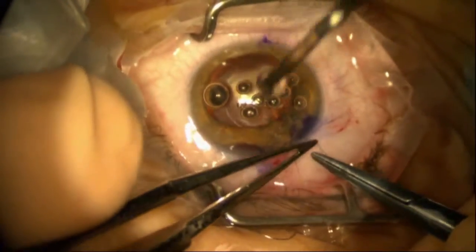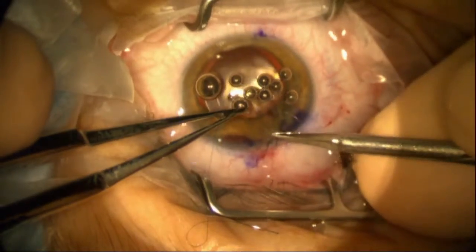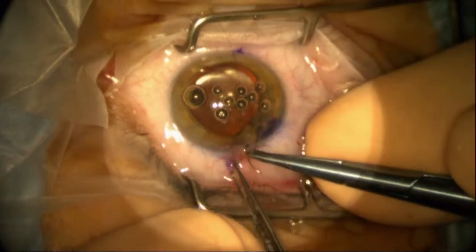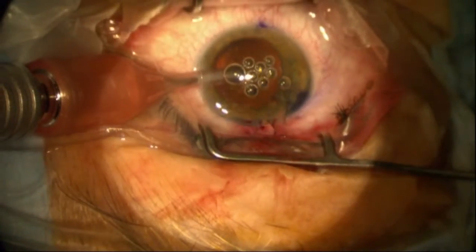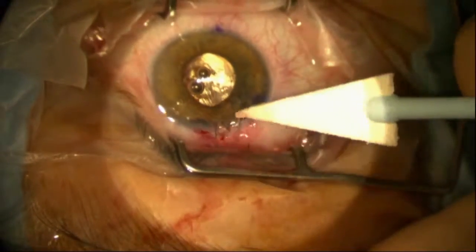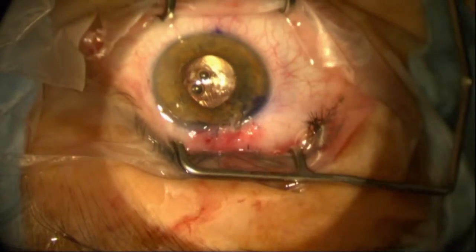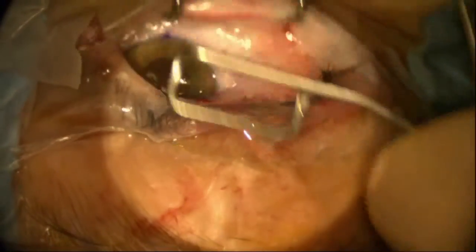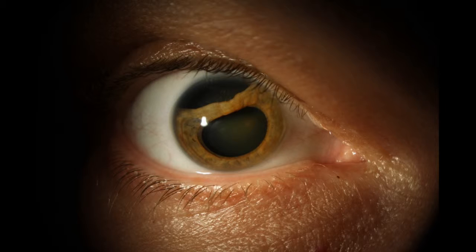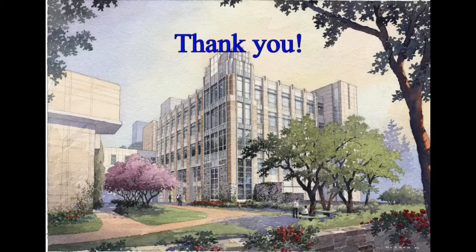A couple of colleagues have suggested Hoffman pockets for this, and I think that's a very appropriate and elegant way of repairing this. Fortunately, after removing all the viscoelastic from a separate incision, the patient not only did extremely well, but was incredibly impressed that his pupil ended up not only round but reactive to light. There's the pre-op — you can compare that to the post-op — and it worked out extremely well.